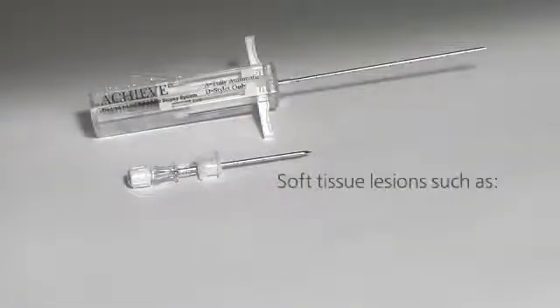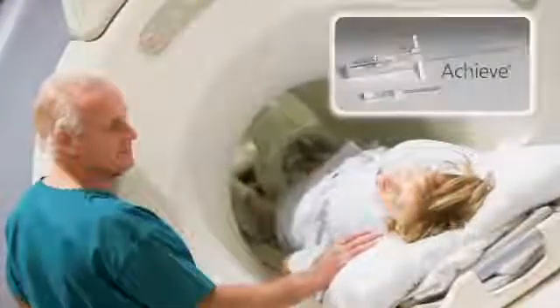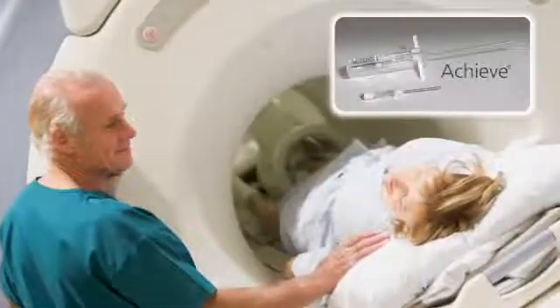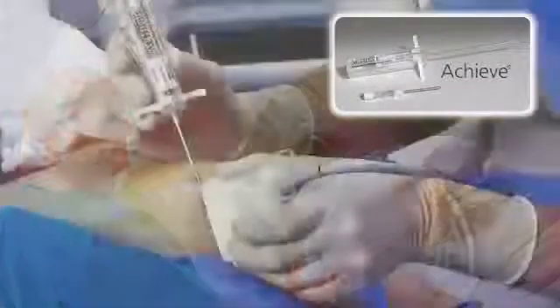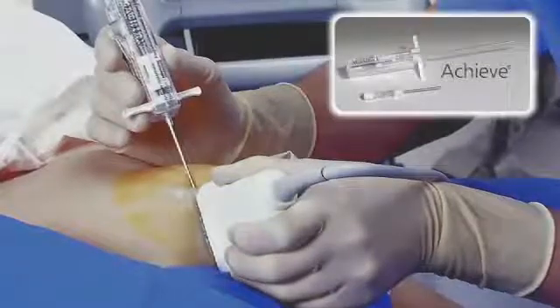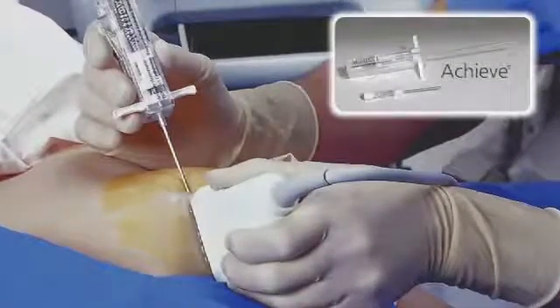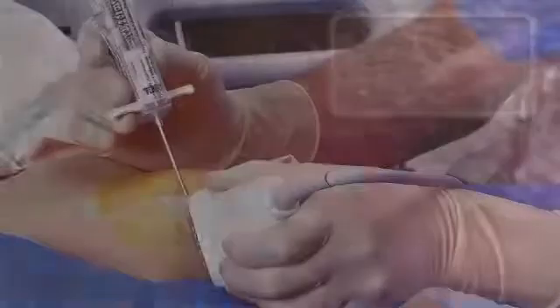Applications include the breast, liver, kidney, or prostate. Achieve is lightweight, making it ideal for CT and ultrasound-guided procedures. The one-handed design simplifies loading and operation and allows for convenient manipulation of an ultrasound transducer.